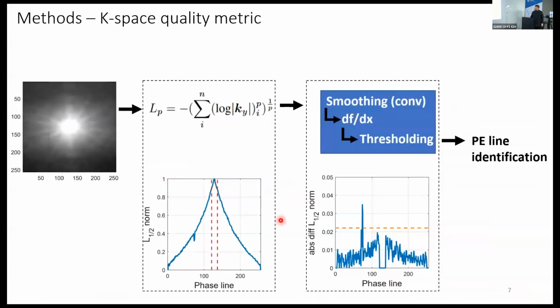And so in fact, as a byproduct of this subproject, ROCO, we developed a little algorithm which we use as a K-space quality metric, thanks to these lines in K-space, which come from reconstruction with the ESPIRiT algorithm. We take the raw multi-coil data, we reconstruct it, and we obtain K-spaces like this, with the appearance of these bands, and we can detect them using, here you can see the formula for the LP norm.